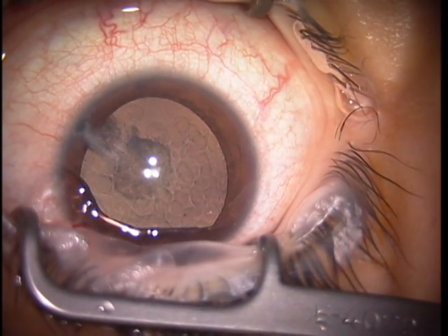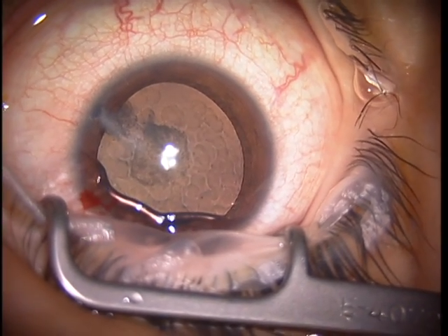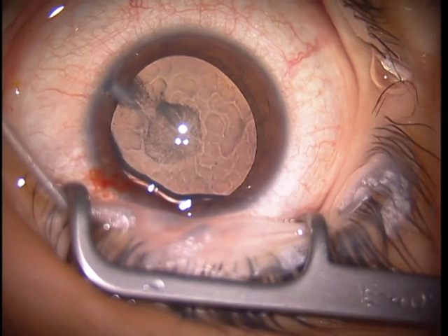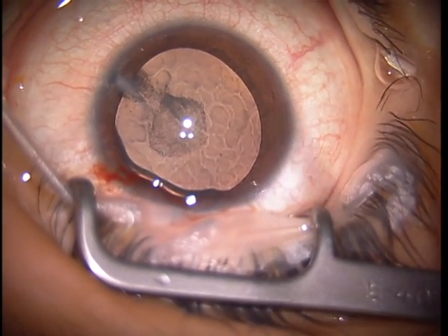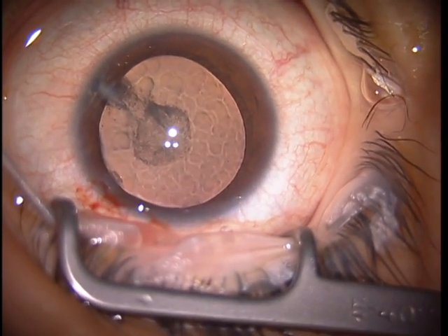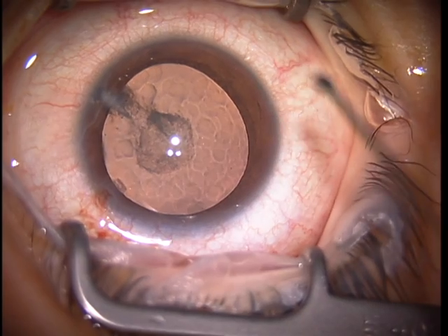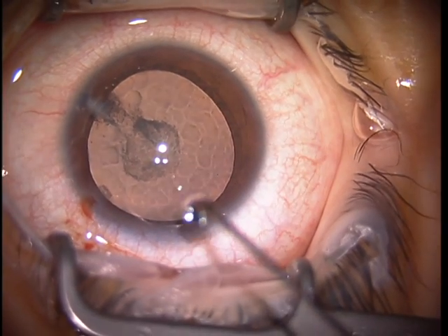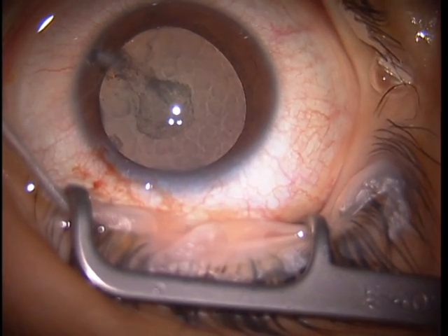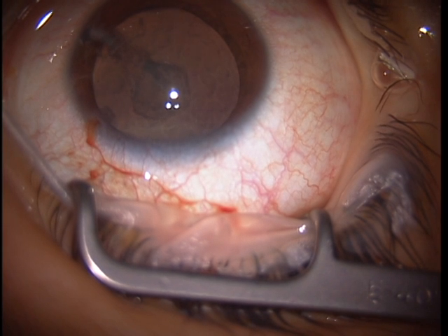Trypan Vision Blue is a real asset for the white cataract. The viscoelastic I prefer in this type of cataract, in young people, and for me in general, is Helon 5 or Helon GV — a very cohesive viscoelastic — because it has the most pressure effect to flatten the capsule, to avoid radializing tears when puncturing the capsule and when taking the tear around the circumference.